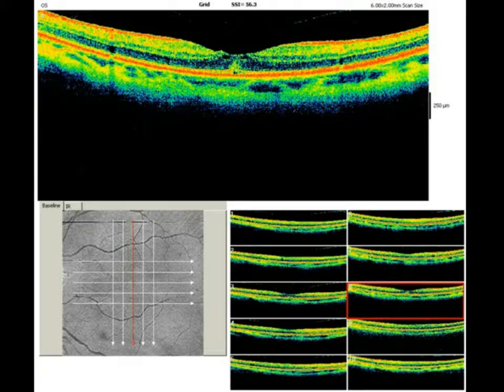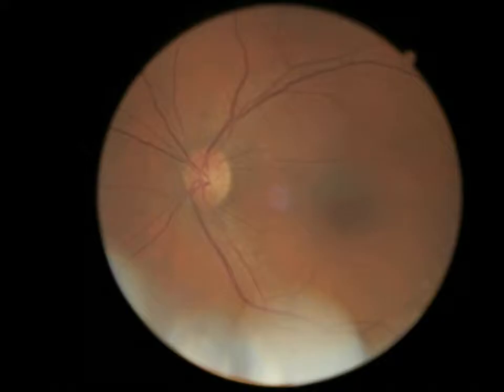And again, you can see in that upper view exactly where those two attachment points are of the vitreous to the underlying retina, where it's actually pulling on that individual's macula. This is another example of an individual who came into the office saying, my vision's just a little bit fuzzy in two little spots in my macula. They're actually a monovision contact lens wearer with a reduction in their vision up close. And when you run the OCT scans, you can see exactly why this happened.